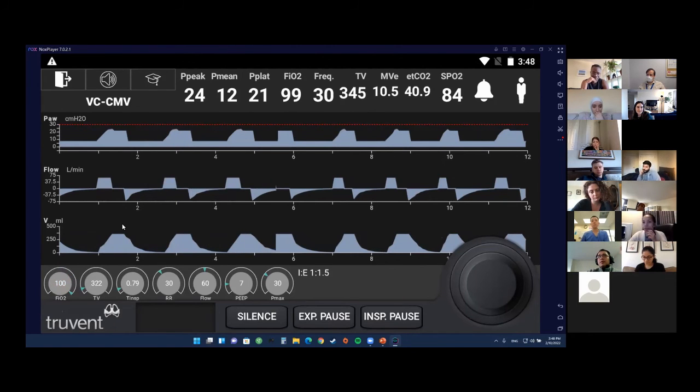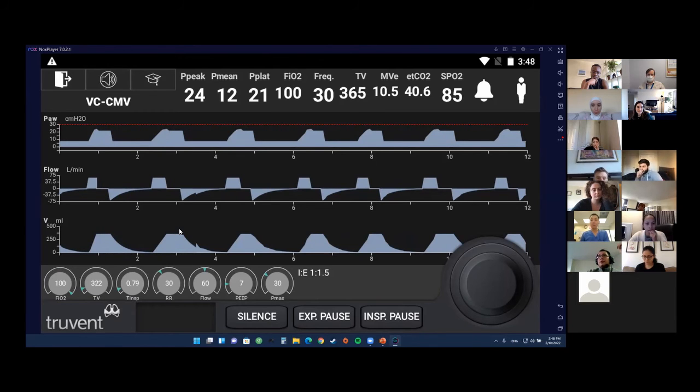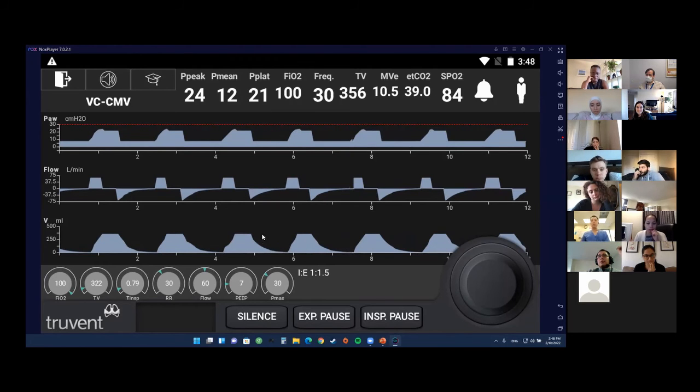What are we missing? The respiratory rate is at 30. Okay, is the patient breathing comfortably at 30? Meaning, is the patient breath stacking? No. You can say macroscopically no, right? No, he's not. Like if you start splitting hairs, you're going to say that yes, but in reality it's not. Does the patient have a good IE ratio? No. It can improve a little bit.